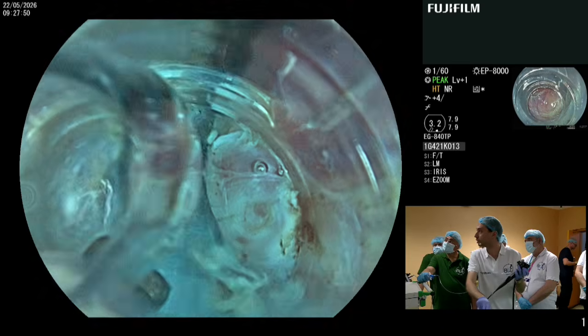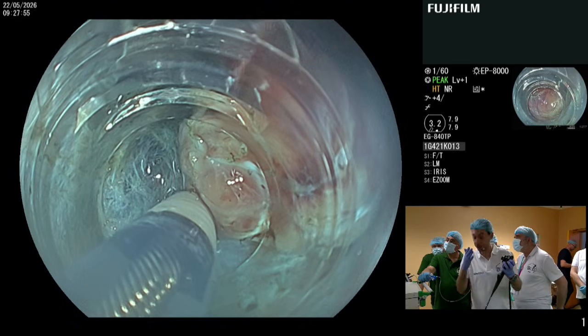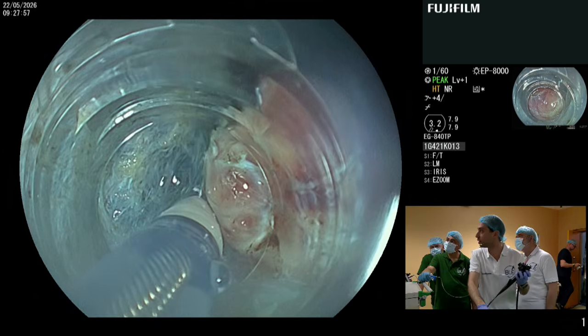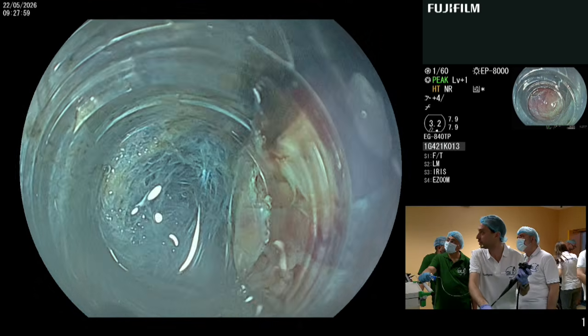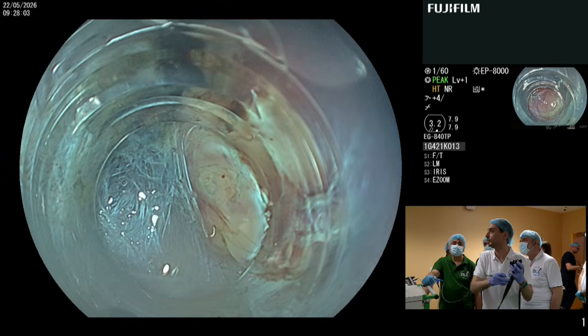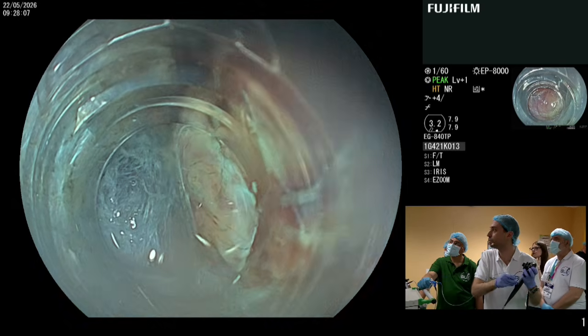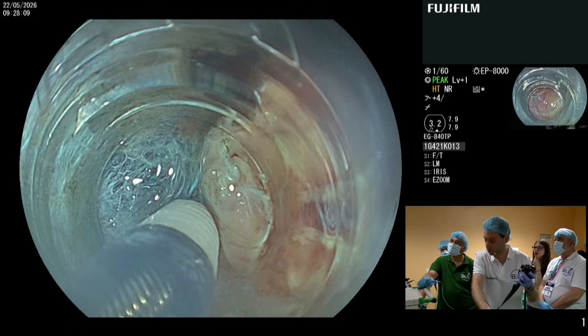All right. So the advantage of having a very slim endoscope is that you can move around the lesion much easier, and here you can appreciate also the advantage of a tapered cap. Thank you, Georgios, for the great demonstration.